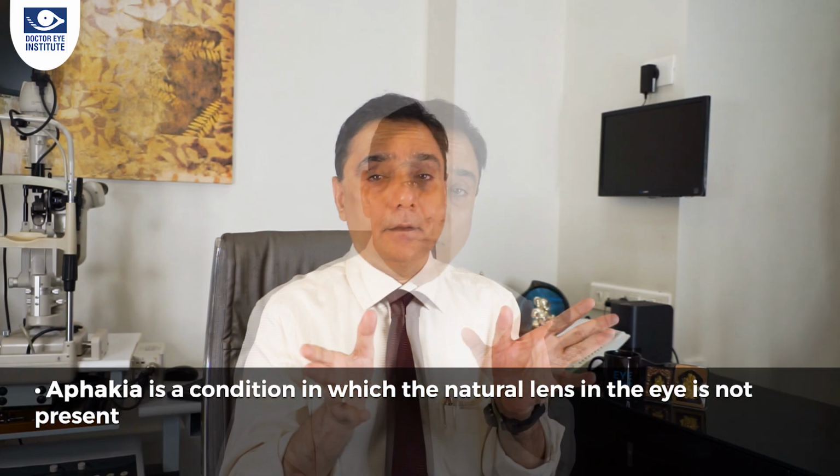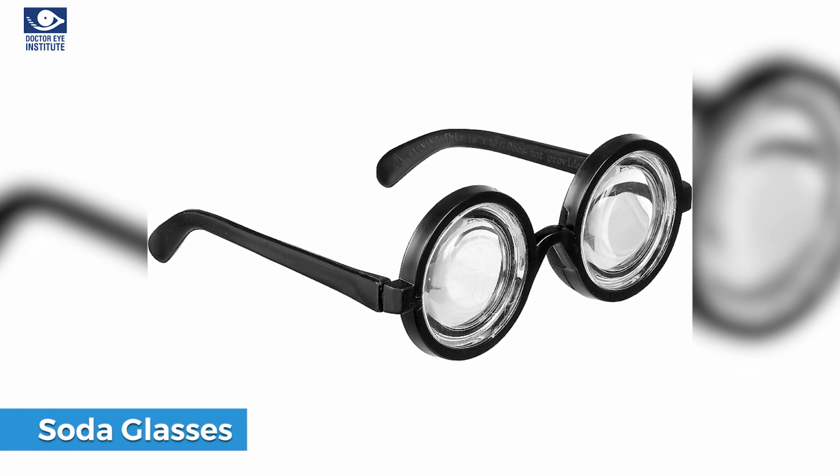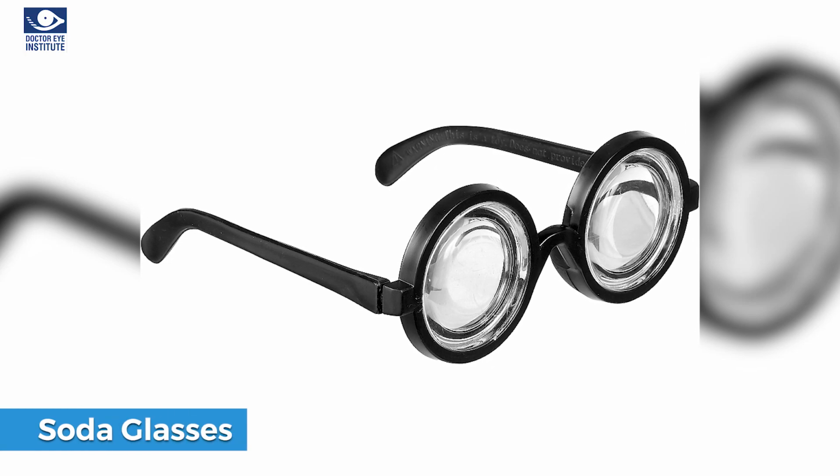In my 5th episode, I spoke about the oldest technique called couching, which actually was removing the lens from its natural position, and this left the patients aphakic. Way back in the 60s, there were no IOLs. So what used to happen was we used to remove the cataract, and then give those thick soda glasses. A patient would normally get a plus 10 number for distance, and you add 3 more, so a plus 13 or a plus 14 number for reading.